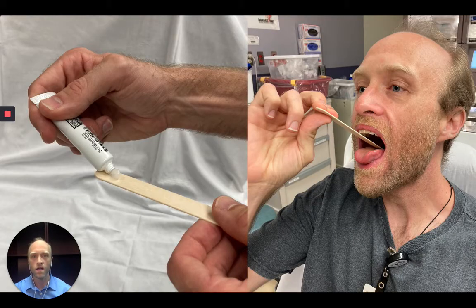So to start, you will use a tongue depressor and the 4% lidocaine cream to anesthetize the posterior tongue. Place a dollop about the size of your fingernail on the end of the tongue depressor and plop it way back on the posterior third of the tongue. This step is very important, as in most individuals, the gag reflex is incredibly acute, thus it is paramount to anesthetize this area well. You then will slowly move the tongue depressor back and forth, let the lidocaine melt and drip down onto the epiglottis.